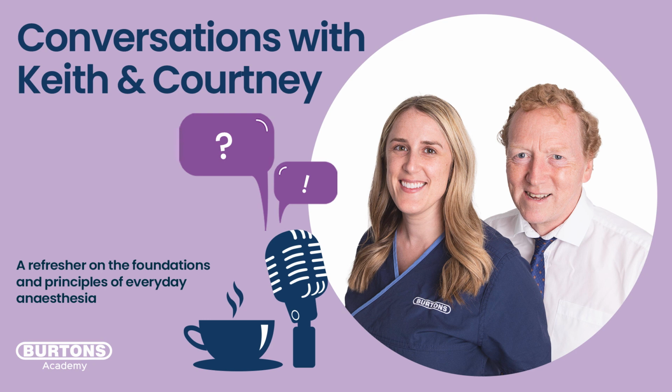Okay, well, just to wrap up this podcast on capnography, what would be your biggest take-home point or just realization point about capnography that you wanted to share with everybody? Okay, I think capnography is one of the best monitoring tools we have, and it gives you the clearest insight into how well that animal is behaving in its ventilatory and respiratory function under anesthesia. So if you disregard all other tools, focus on capnography.